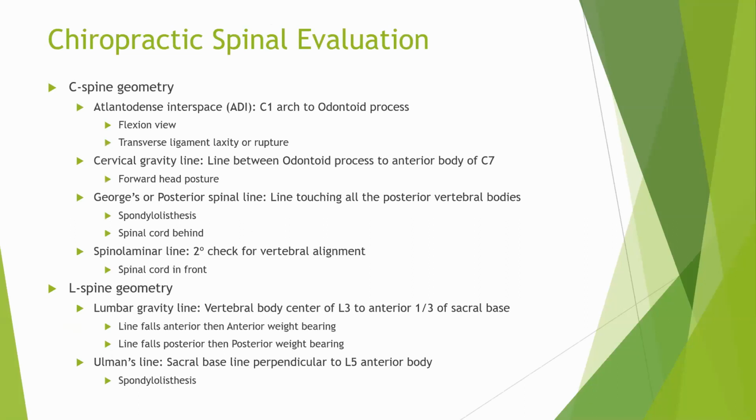So now, chiropractic spinal evaluation. What do I mean by that? Essentially, you have C-spine geometry and L-spine geometry. So what is C-spine geometry? I'm not sure if you have heard these terms or not. I do have pictures in the next slide, so please bear with me.